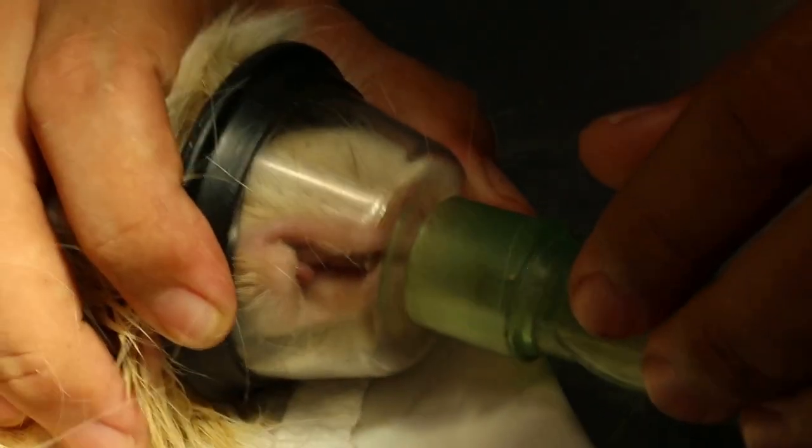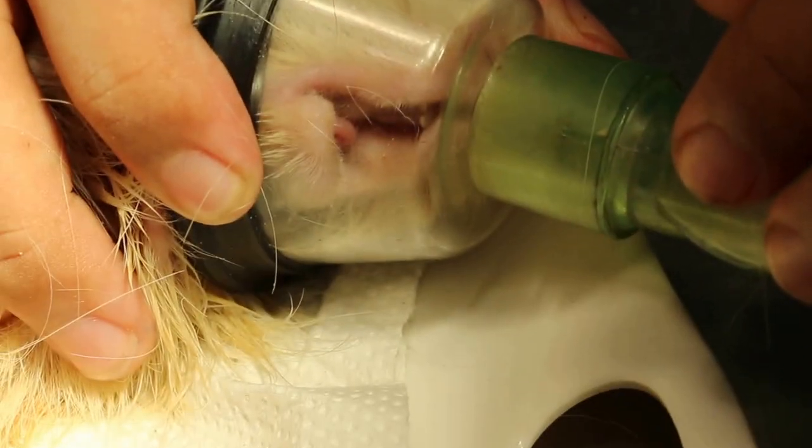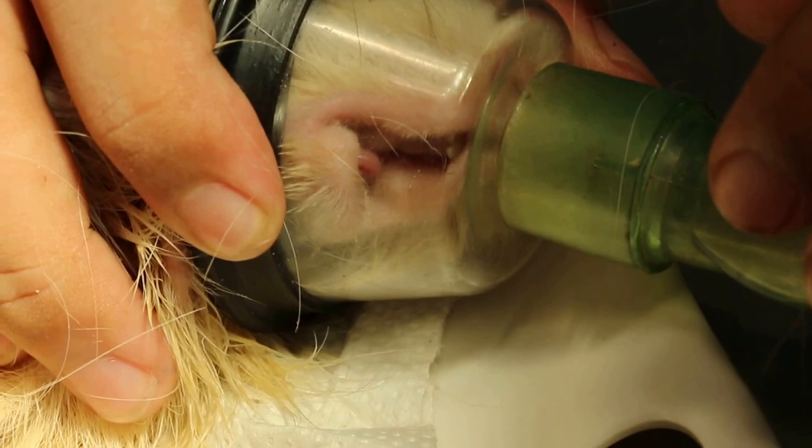Or even chinchillas — you might need to go under gas anesthetic to check. Now I'm going to clip already.